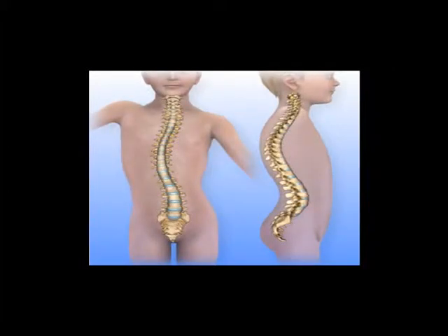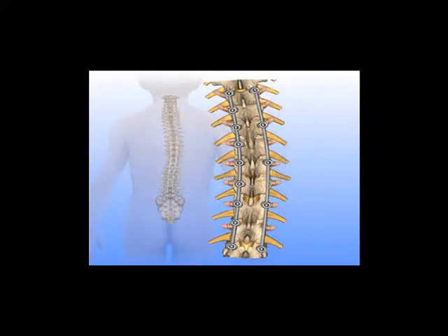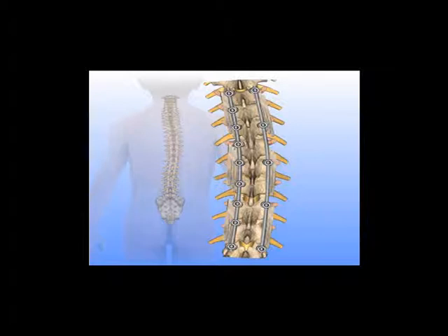Scoliosis is an abnormal curvature of the spine. Correcting scoliosis usually involves placing multiple screws or hooks along the length of the curve and using instrumentation to decrease the curvature. Bone grafts or bone graft substitutes may be added to fuse the vertebrae in a straighter, less curved spine configuration.